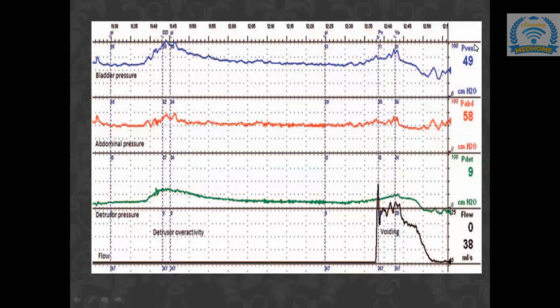Okay, ma'am. This is vesical pressure, and below is the rest.